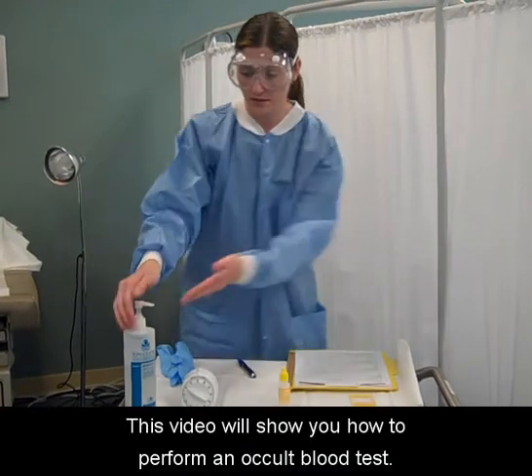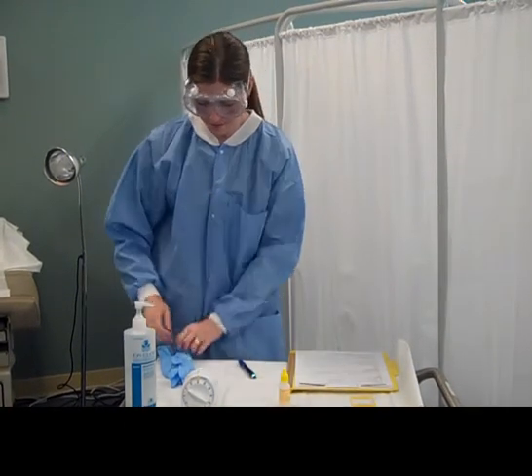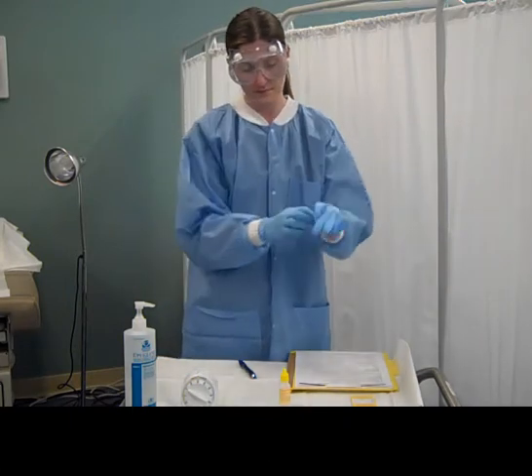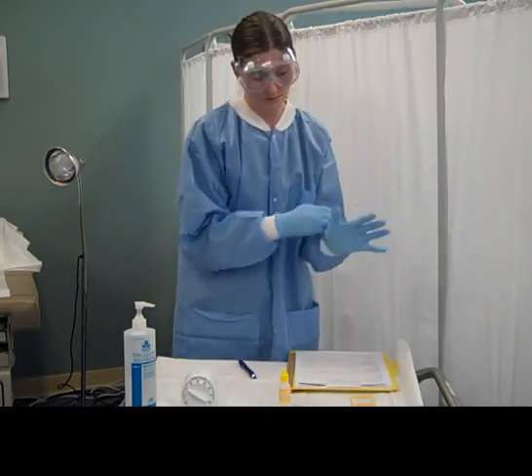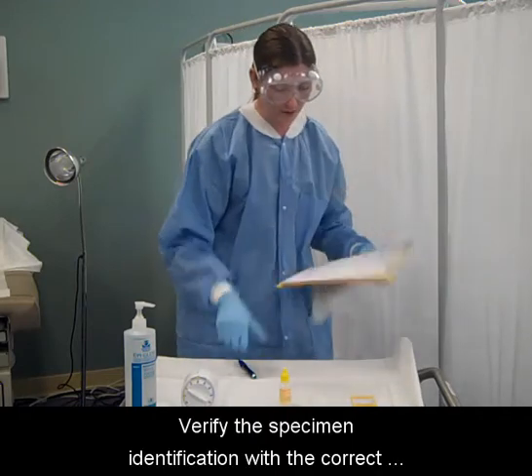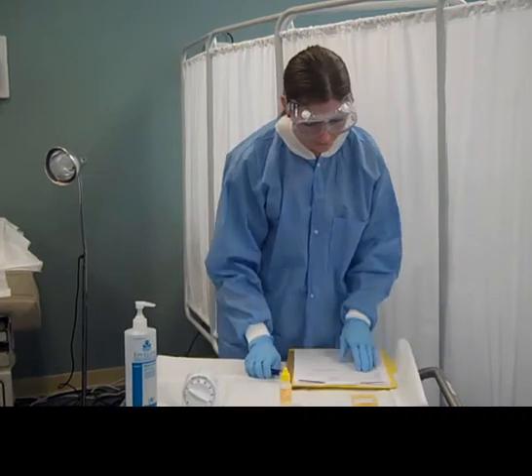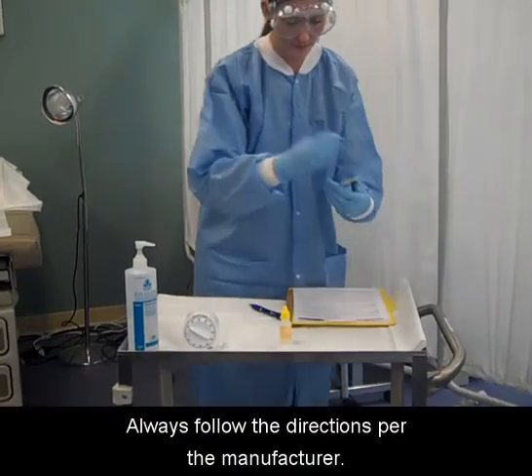This video will show you how to perform an occult blood test. Wash your hands and put on gloves. Verify the specimen identification with the correct patient's chart. Always follow the directions per the manufacturer.